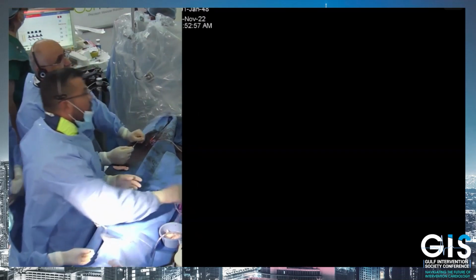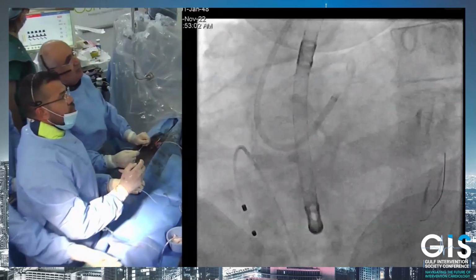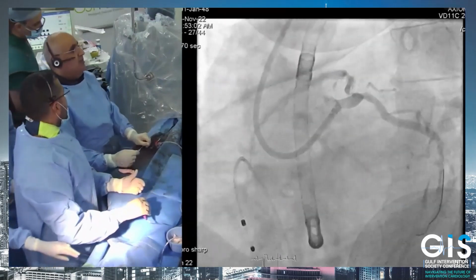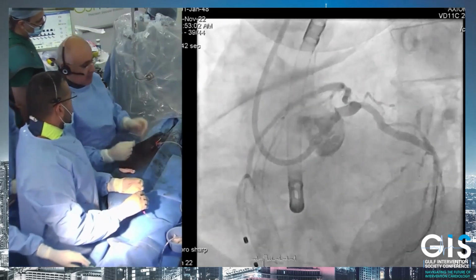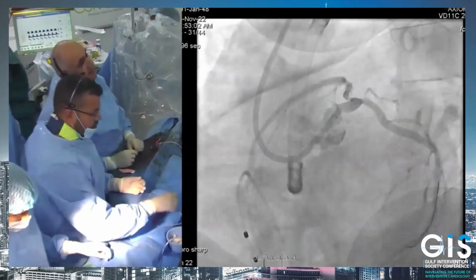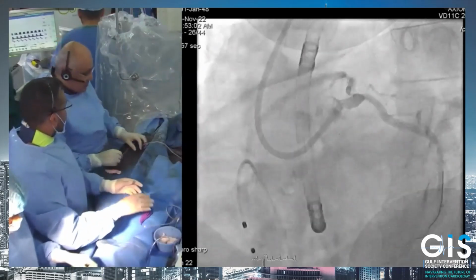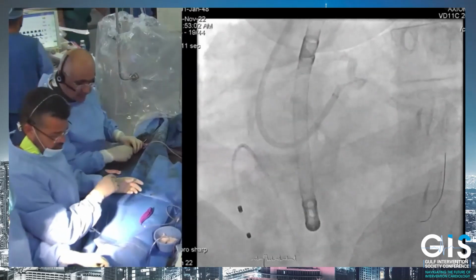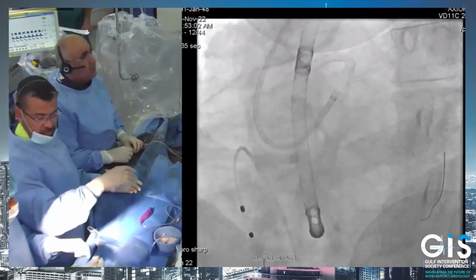Can I see before you go further? I'll give you one injection here. So you see that angulation, it's quite an ugly angulation. I don't know how much calcium burden is there, but we will have to deal with it. So I'm taking a Sion to cross that one, and then maybe exchange, and we do an image if possible, though I think it is going to be difficult, but let me try. Okay, so Arif, the floor is yours, you can try to cross that, and we'll discuss with the panelists what happened and what their strategy is next.